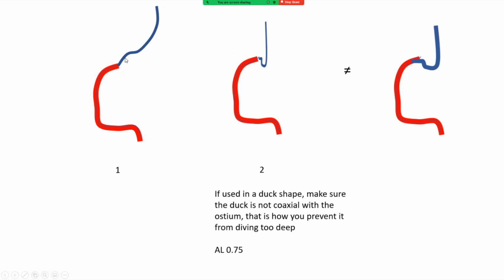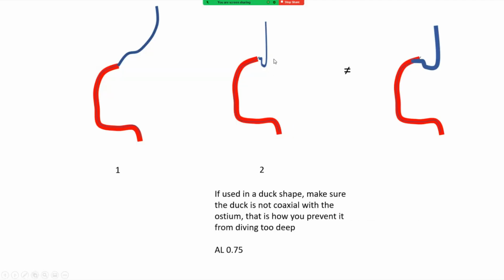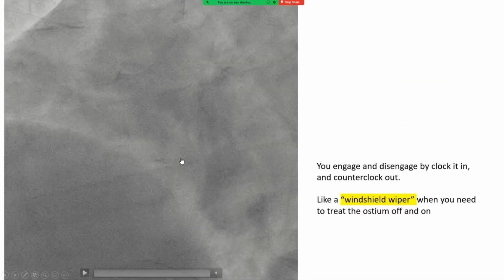So you can use it in an elongated fashion where you advance and disengage as needed, or in a duck shape on the aortic valve, but not coaxial. Do not use the duck shape coaxial with the coronary. This is an illustration of how you can engage and disengage by clocking and counterclocking without ever getting too deep in the coronary. This is an Ikari left here, but the same idea applies for an Amplatz left positioned in a duck shape but non-coaxial.